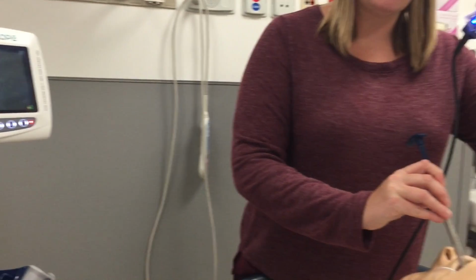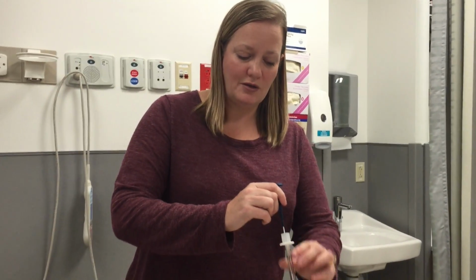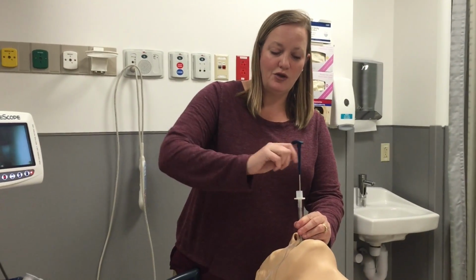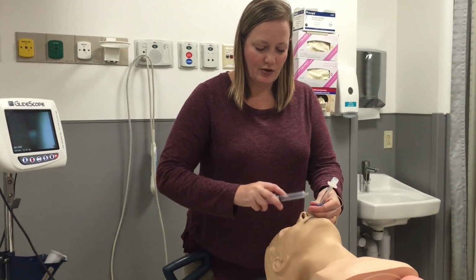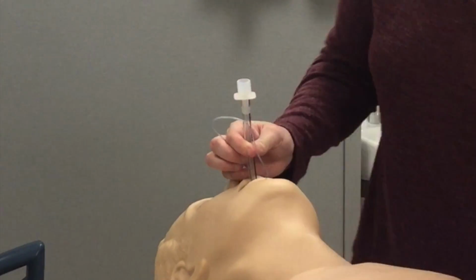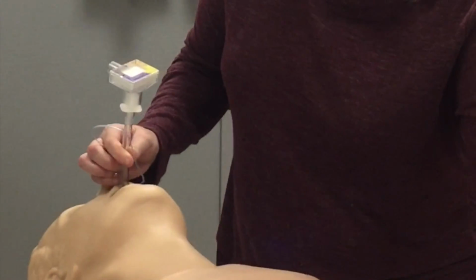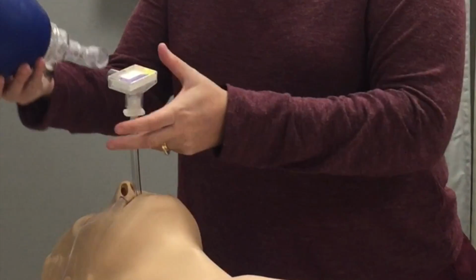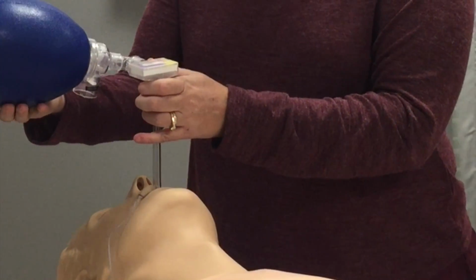At this point, you may take the glide scope out of the patient's mouth, and making sure that you're holding on to the patient's endotracheal tube, you will remove the stylet away from you and away from the patient. You will inflate your cuff, and then, without letting go of your ET tube, you will place the CO2 detector on the tube. You'll place the bag on the CO2 detector, and you will bag the patient.